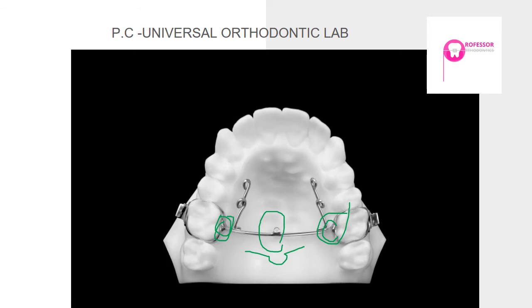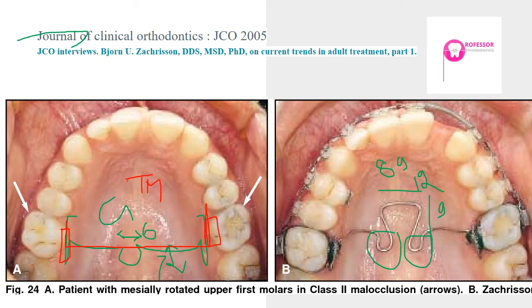The classic Goshgarian TPA has a bend, a distally directed loop, and another bend — this is what a regular TPA looks like. It is called the Goshgarian palatal arch because it was introduced by Robert Goshgarian. It is made of 0.036-inch stainless steel wire with a rounded cross-section.